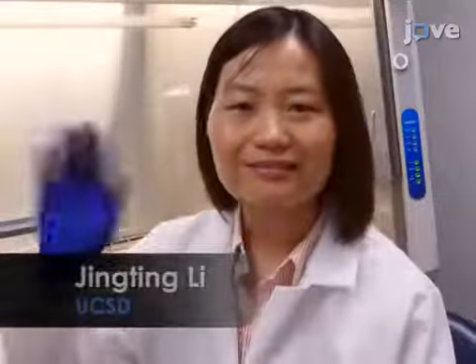The main advantage of this technique is that genetically altered human skin is generated within a few days, which allows the study of human samples that are potentially clinically relevant. Demonstrating the procedure will be Jingting Li from my laboratory.